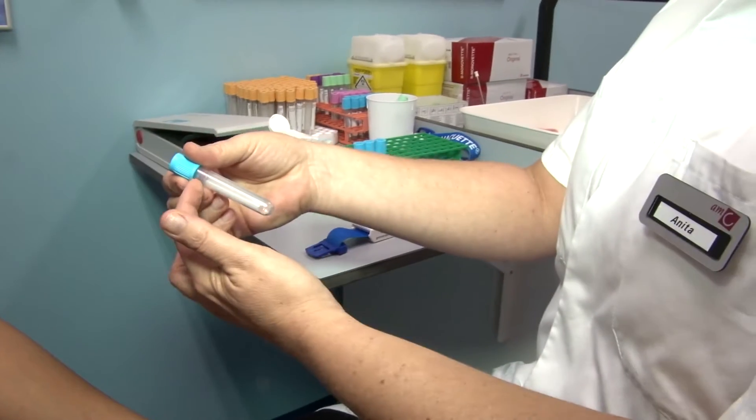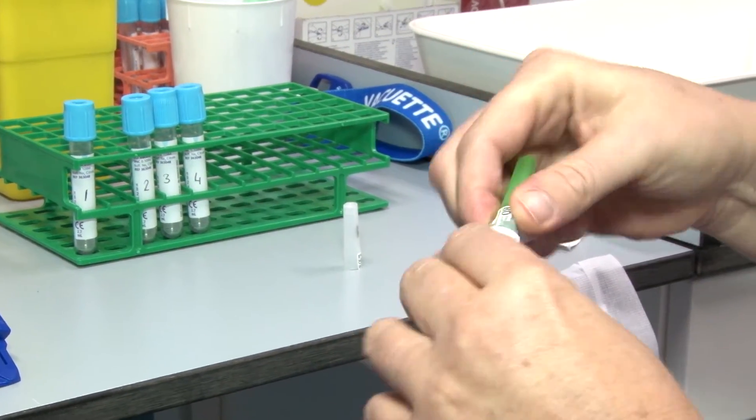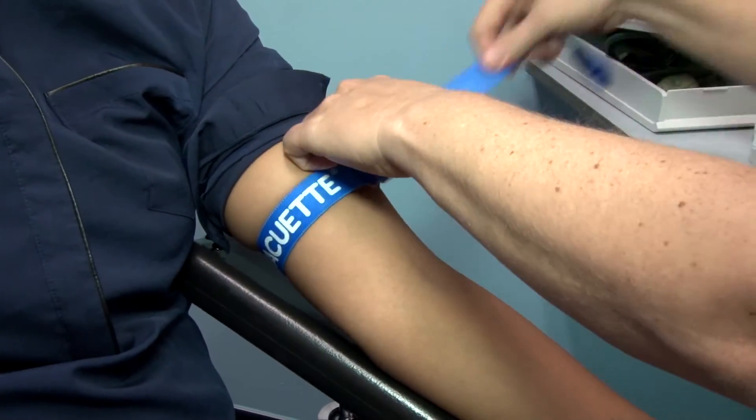For the collection, we're going to use a citrate tube, and for the needle, we're going to use a needle with a diameter of 21g. The application of the tourniquet is only for locating the vein.